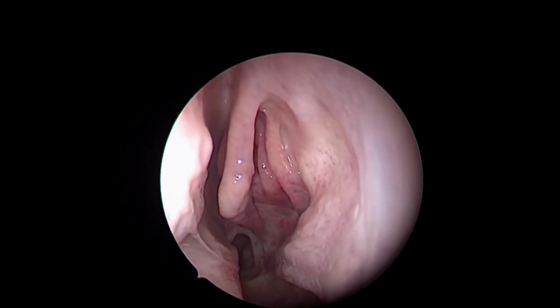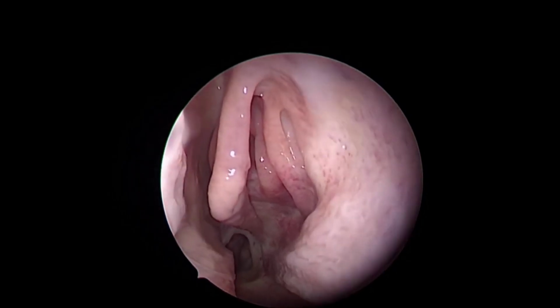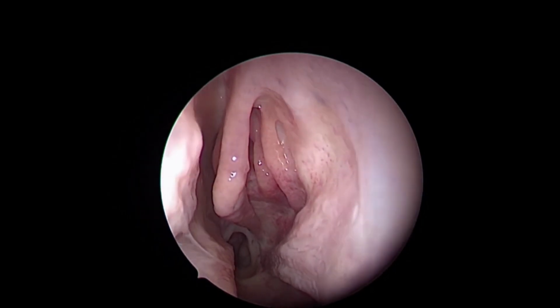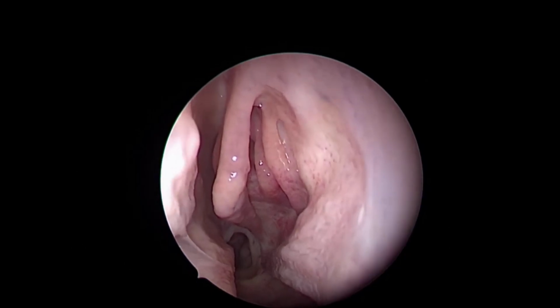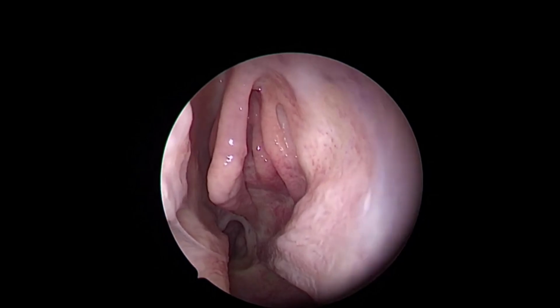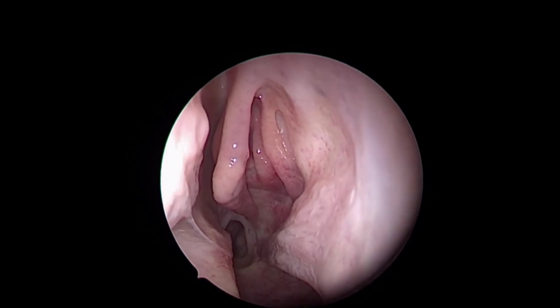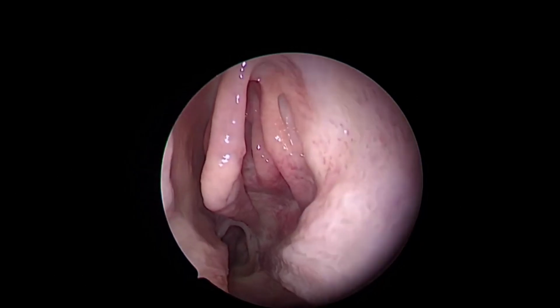We'll discuss all extended approaches to the frontal sinus, as many as 5 types of Draf or modified Lothrop's procedures, along with the open procedures like osteoplastic flap, cranialization of the frontal sinus, facialization, orbital transposition to go far laterally into the frontal and all that.